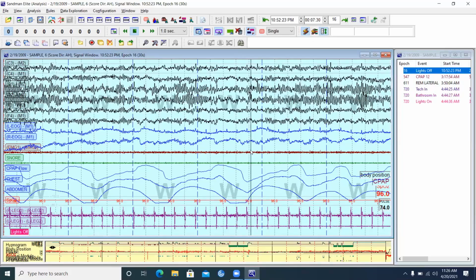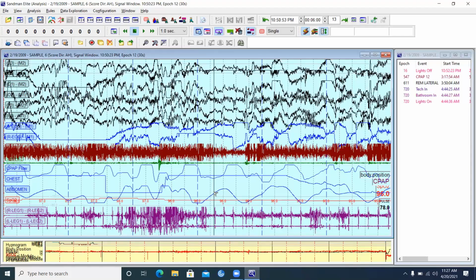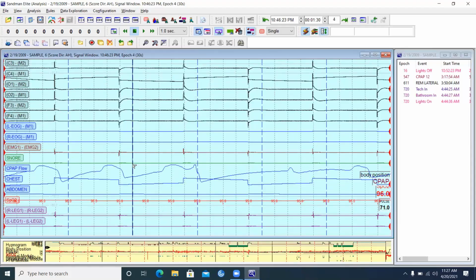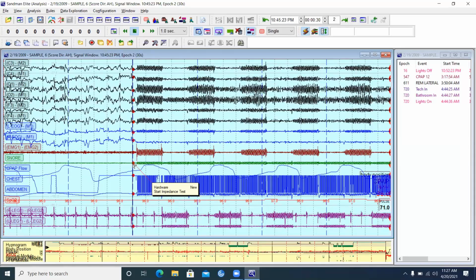We talk about biocalibrations. Biocalibrations are the calibrations that we have to do at the beginning of every recording. We're walking the patient through, on page 4 of this lab, eyes open, eyes closed, and so on. When we do a study, and this really comes back to the electrical theory, first you have to hit start recording, and then you do an impedance recording. So it's recorded as part of the study. So that's where you see this here.